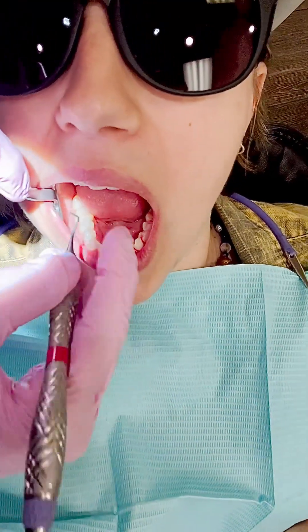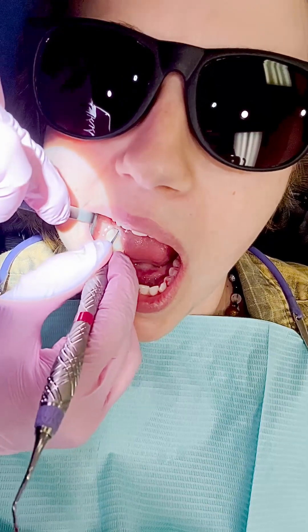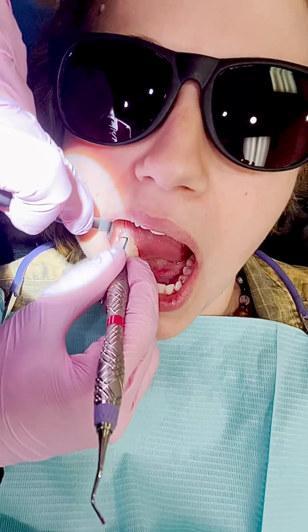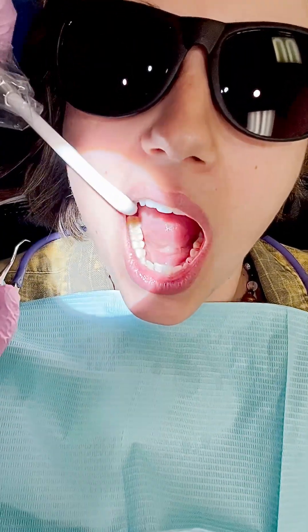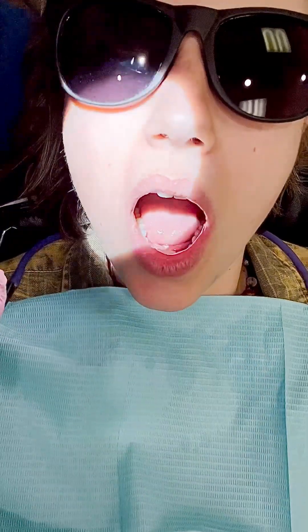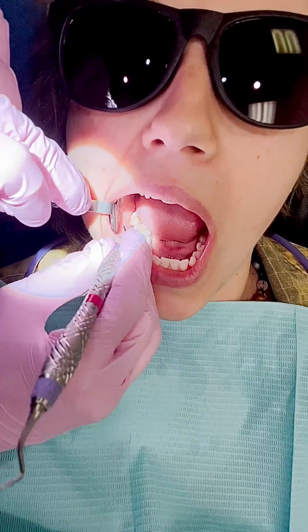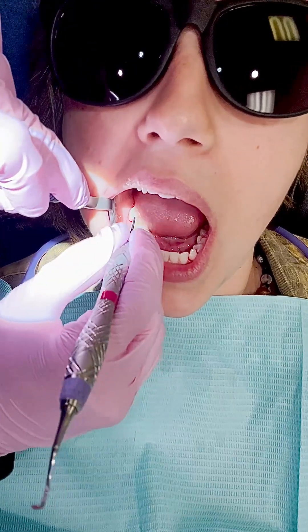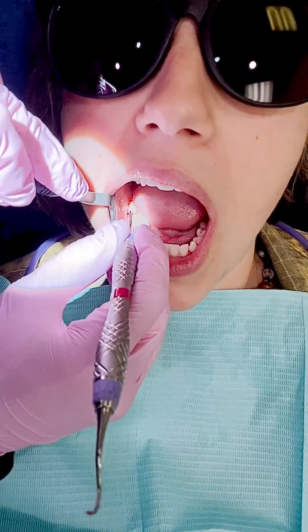Still with my sickle, I'm going to the other side — going around the distal, working my way in, fulcruming on the chin with my fingertips. I'm just retracting. You could use your finger — you don't have to use the mirror. Fulcruming on the chin and lip, working my way around, going up into the contact.